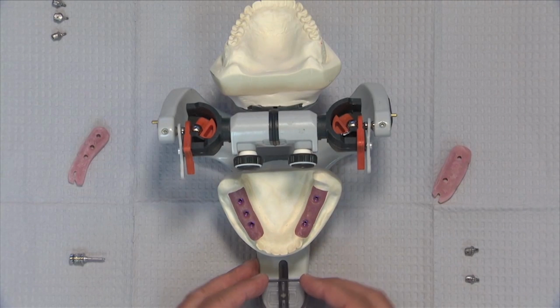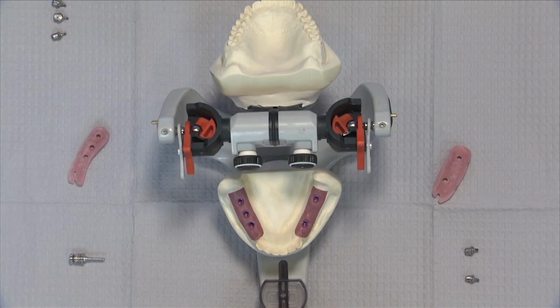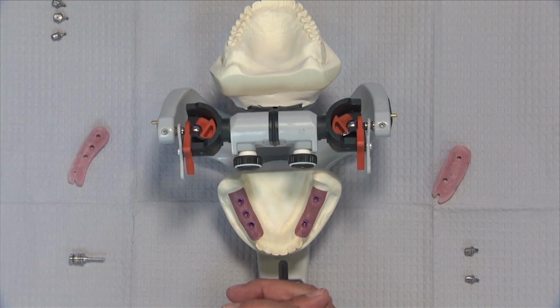So let's look at a patient who's had 5 implants placed here in a bilateral edentulous area. And now we're going to go ahead and take our impression. So we're going to put the transfer copings into place, into the implants. And of course, you're going to want to take an x-ray, a digital x-ray hopefully, to verify that these copings have seated all the way onto the implant. And then we're going to take our implant level impression. We can do this with a closed tray method or an open tray. It really doesn't matter, but we want to make sure that that transfer coping is completely seated on the implant, and then we're going to take that impression and send the copings and the impression to the laboratory.